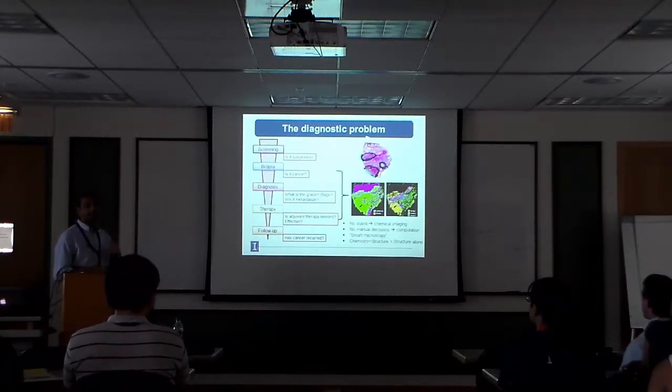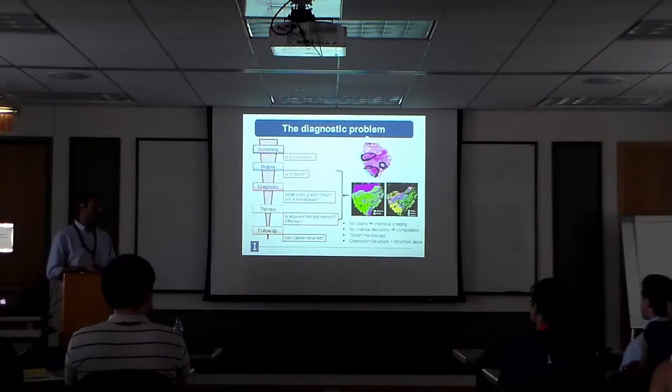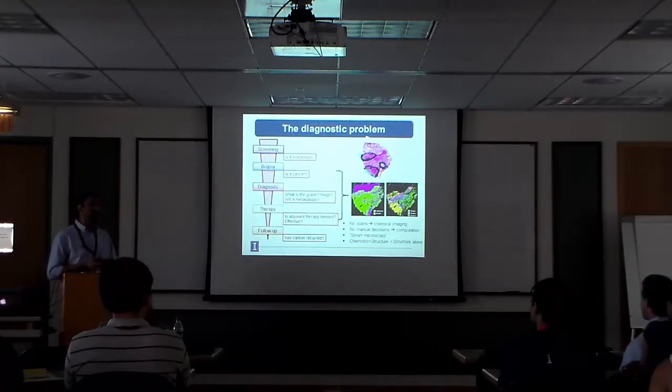Again, there's a whole world out there. This spectrum could be a mass spectrometer-derived spectrum, for example. It could be near-infrared. It could be other kinds of spectra. It turns out that in the infrared and Raman, as you heard in the talk last week, the fundamental vibrational modes are measured. So fundamental molecular changes, or fundamental interactions, are measured. In the near-infrared, for example, overtones and combinations are measured, so the information is much weaker. In mass spec, you only measure proteins. You don't measure nucleic acids. You don't measure lipids. You could, but you don't measure them normally. You're more protein-focused.